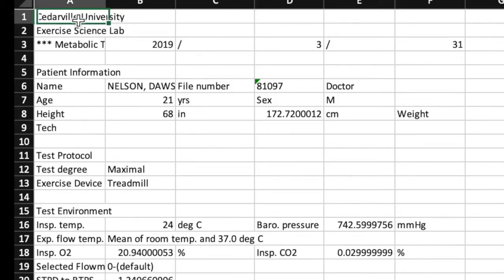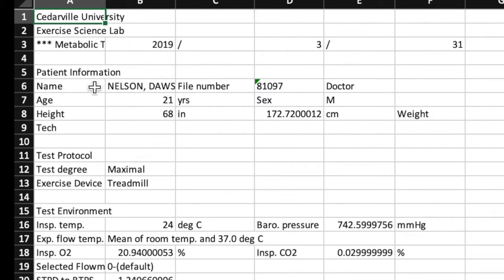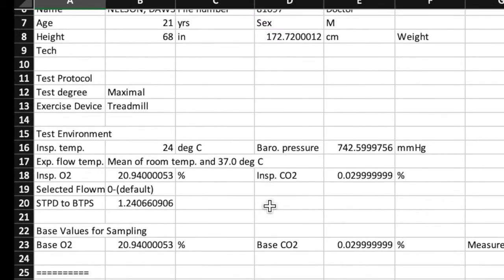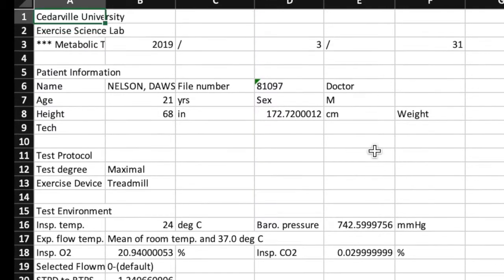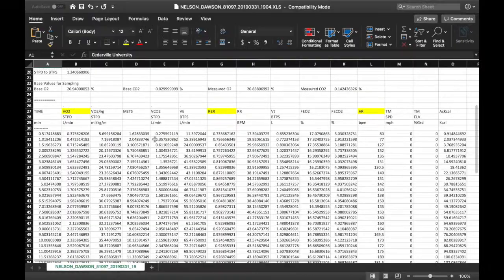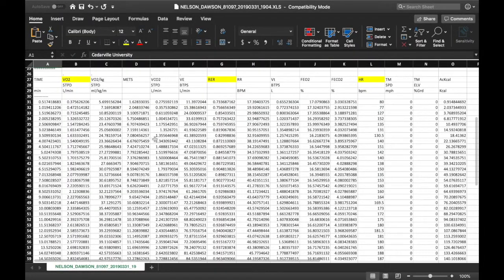Starting at the top, there's very basic information — Cedarville Exercise Science Lab, the date when we did the test, and information about Dawson, our patient, the test protocol, testing environment, and base values for sampling. This is all your basic data, kind of a precursor to the test.